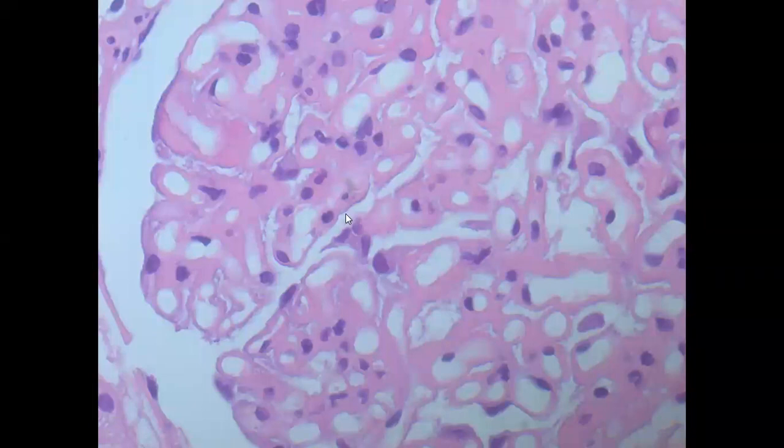As you can see here, this is an H&E stain, and you can see thickened membranes. And these are the podocytes, which are very prominent. And at places, you see that there is non-uniform thickening. You can see a thickened membrane like this, then compare this membrane with this membrane. This membrane seems to be twice the thickness of this membrane.